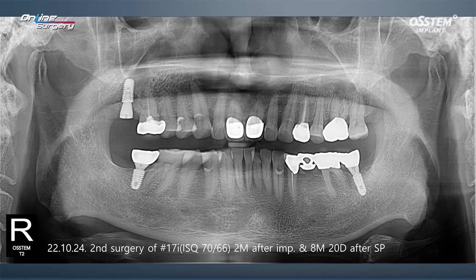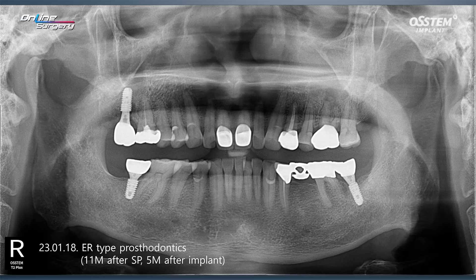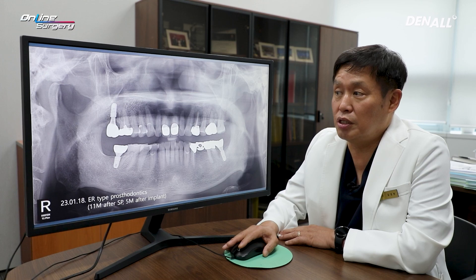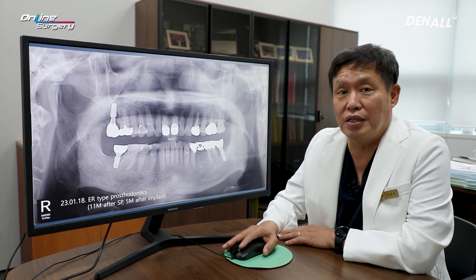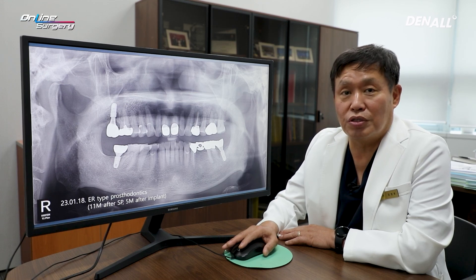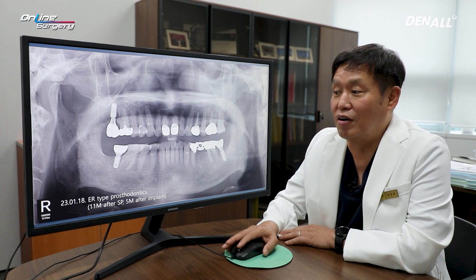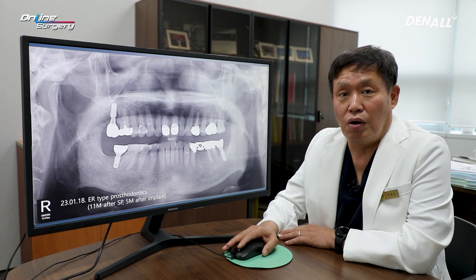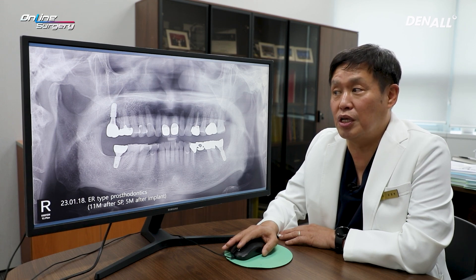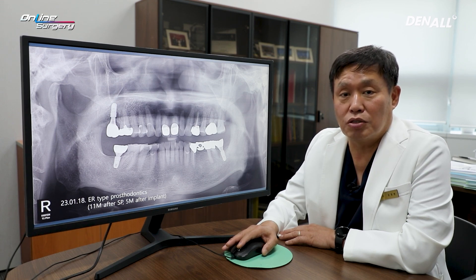The ISQ values at second surgery were 70 and 66. After that, prosthesis was delivered. This was 11 months after the initial socket preservation. This is the panoramic image at 5 months after implant placement. I tried to recall the patient for follow-up, but because the patient did not face major issues, follow-up was not easy. The result was nicely maintained, and if opportunity arises, I would like to show you CT once again.